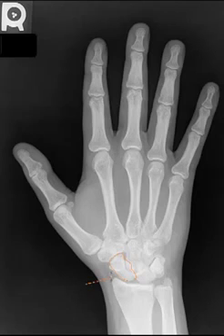Now we want to pay very close attention to the waist because the waist is the most common location, or the midsection of the scaphoid. This is the most common location where fractures will occur in the scaphoid. Now moving on to the next carpal is going to be the lunate. Now this name will become important in just a moment when we get to the lateral projection, because on lateral projections it does look very much like a crescent moon, hence the name lunar or lunate.